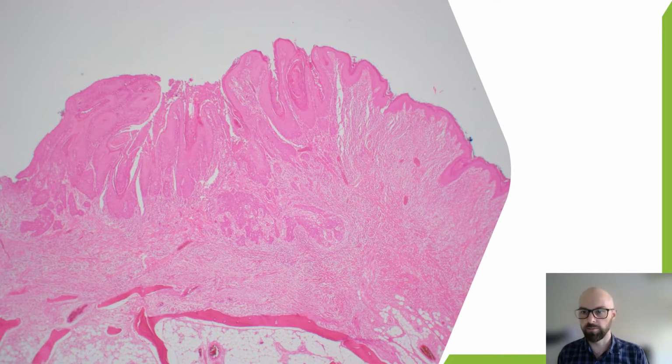This is an example of curved mucosa. So we can see the normal mucosa up here. There's mucosa down here, partially eroded, but otherwise normal. And if we follow the staging manual, what you would do is just draw a straight line all the way across and then a plumb line straight down there to get the depth of invasion. But no one's mouth really looks like this.